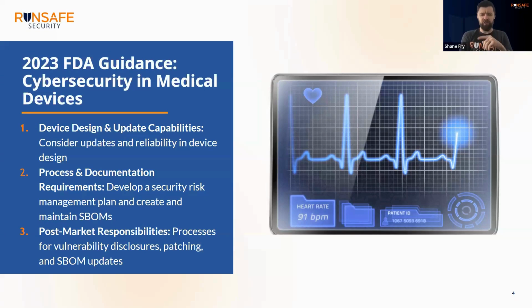So there's definitely a lot to think about in the whole life cycle. And that's why understanding your software bill of materials on the far left side as you're building software is really important, because that helps you mitigate issues before they get deployed in the field.